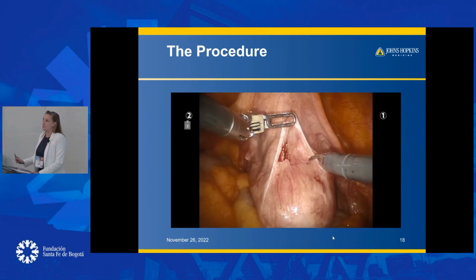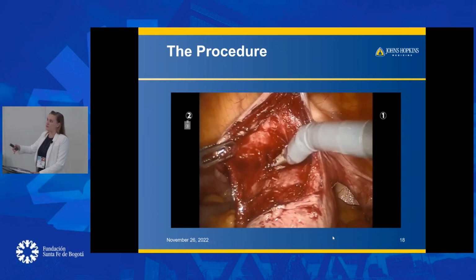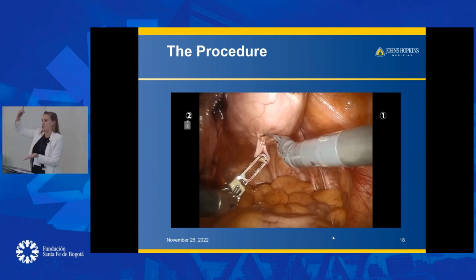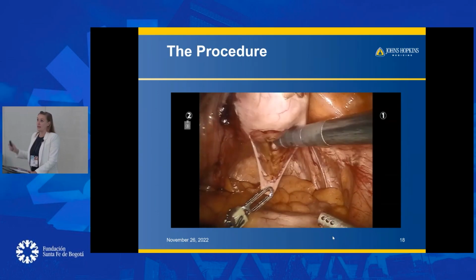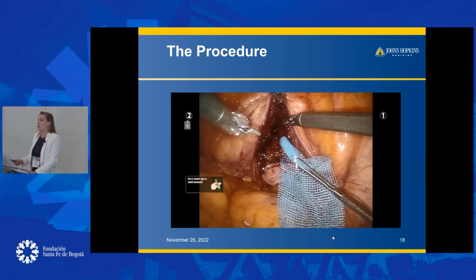He's dissecting, basically cutting the peritoneum, and then he's going to go and create that flap. He's basically using the retractor, and he's scraping up that tissue, kind of separating the tissue from the retractor. And then he has a separate incision for the posterior repair. And so you can see that pocket's always a little bit easier. The anterior dissection is a little bit more challenging.